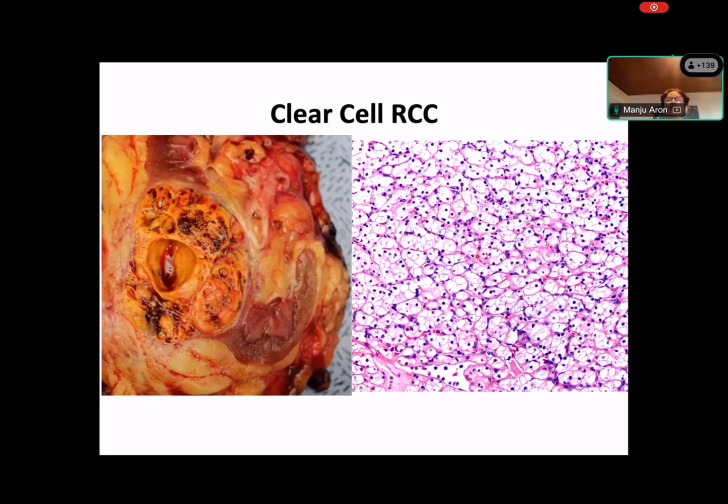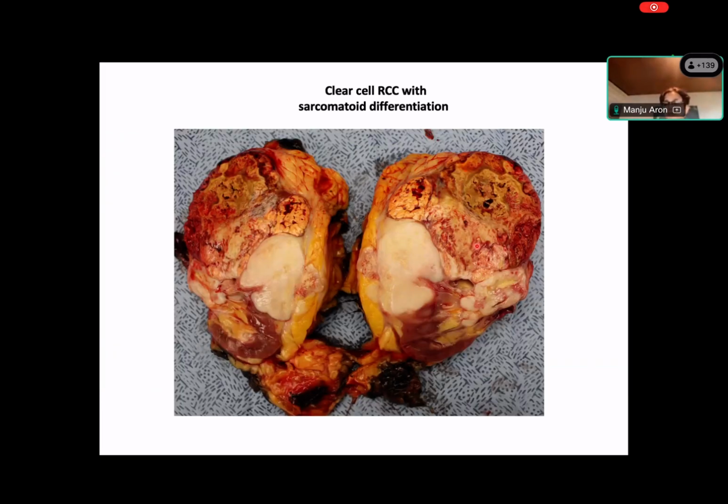You can have eosinophilic areas, but if you see these kind of areas in a tumor, then you know that you're looking at a clear cell RCC, however heterogeneous other areas may look, because it's got that sinusoidal architectural pattern.